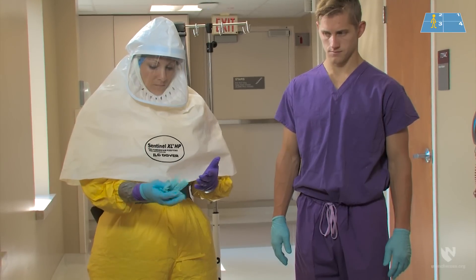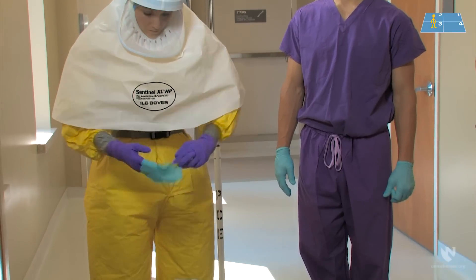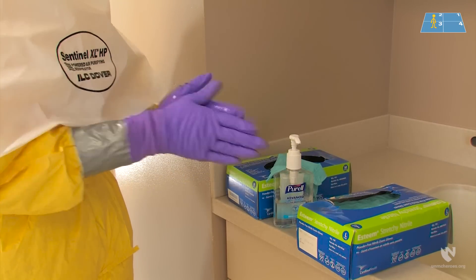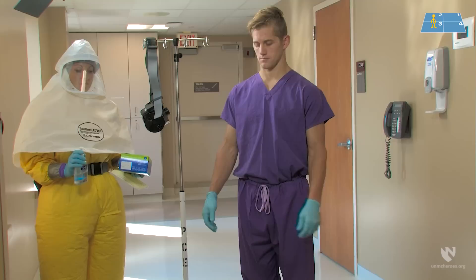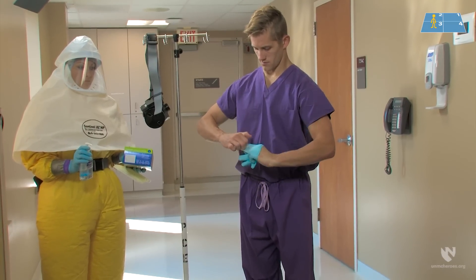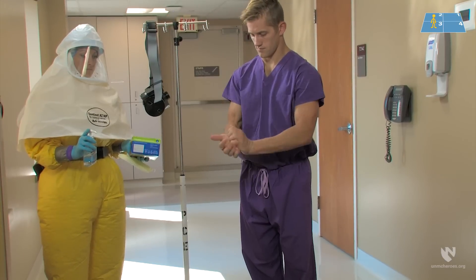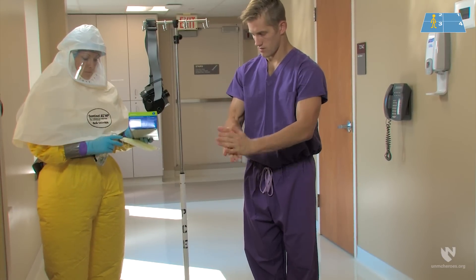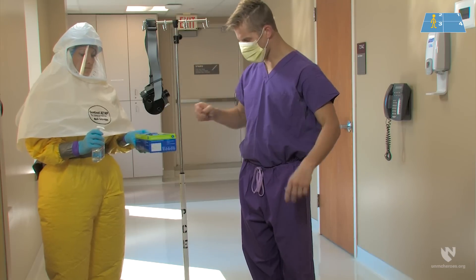Both the healthcare worker and the doffing partner should remove their gloves using glove-in-glove technique and place the gloves gently in the trash. Then the healthcare worker and the doffing partner perform hand hygiene and re-glove. The healthcare worker will apply a patient care mask for respiratory protection.